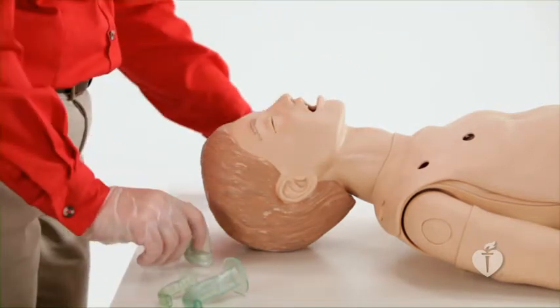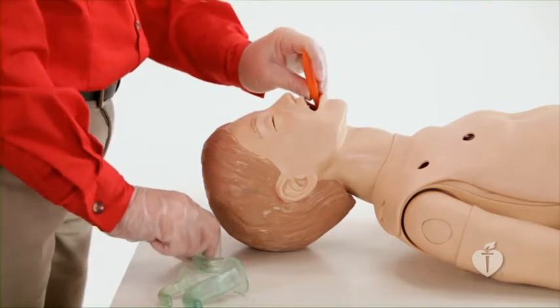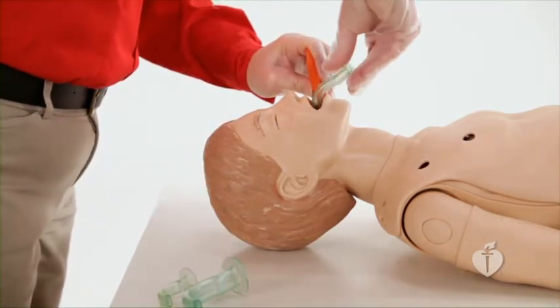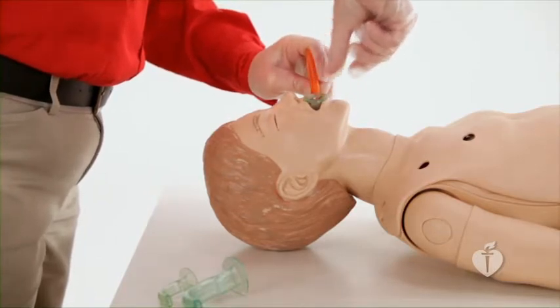One technique of inserting the airway is to use a tongue blade to depress the tongue. The airway may be inserted on its side or in an inverted position and then rotated into place. Remember, the oral airway should not be used in conscious, responsive children as it may cause a gag reflex and vomiting. Effective bag mask ventilation is an essential BLS intervention that will be reviewed in this station.